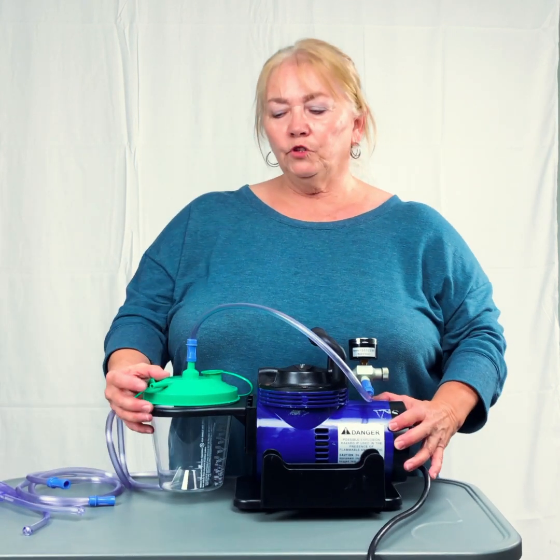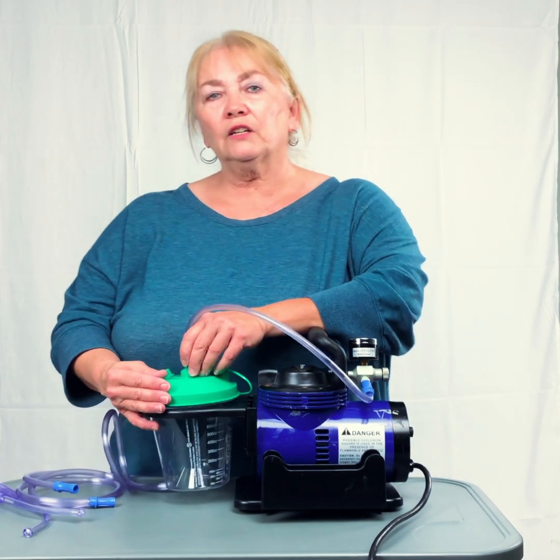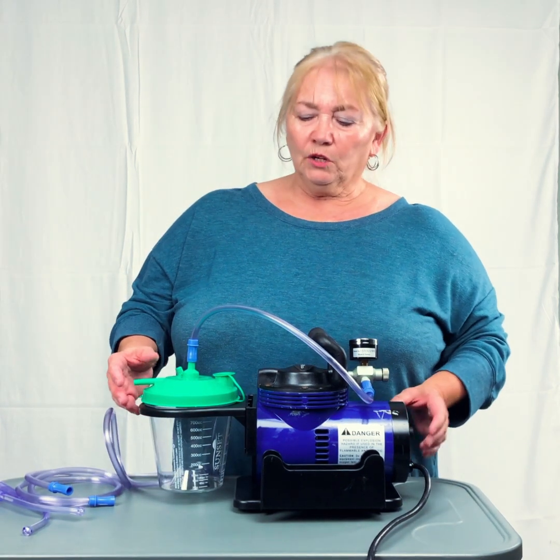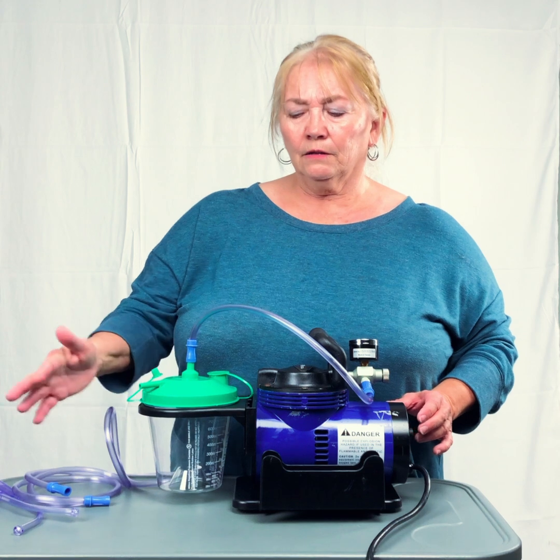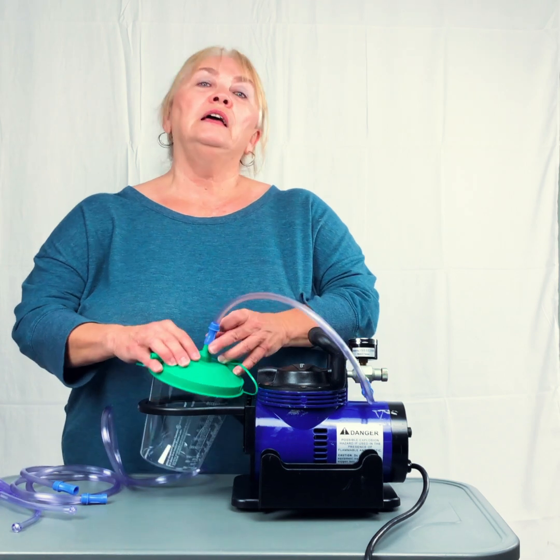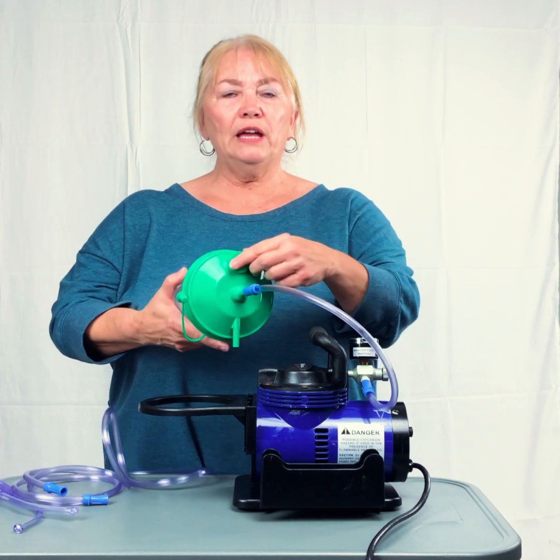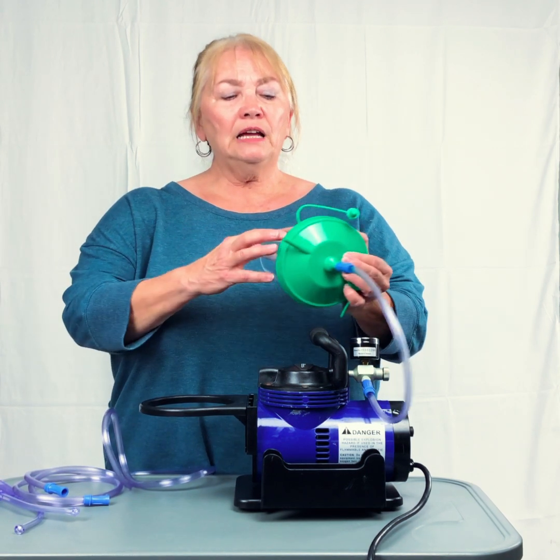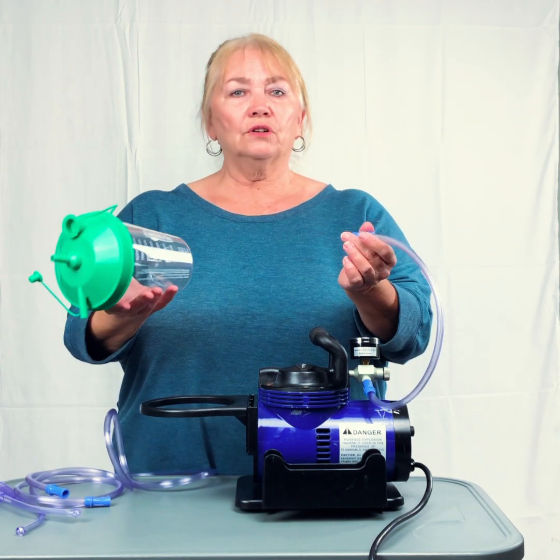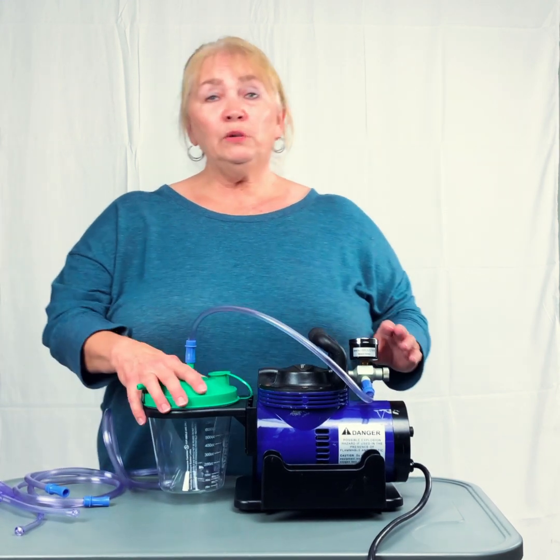Now, when we turn it on, you're going to put your finger over this part here where you would hook the long tubing. What you have to remember is it's going to take a few seconds longer because it has to suck the air out of the canister. So we're going to turn it on, put your finger there. Do you have suction? You do. So we know the canister is good. Sometimes, if you have a problem at this point, you have to make sure your lid's down all the way, that this is covered. Sometimes they'll get a crack in them. Sometimes it's just a bad canister. It's made on a machine. That happens.